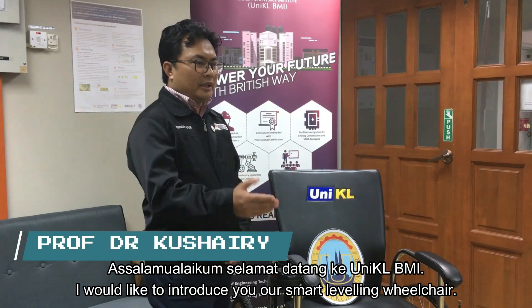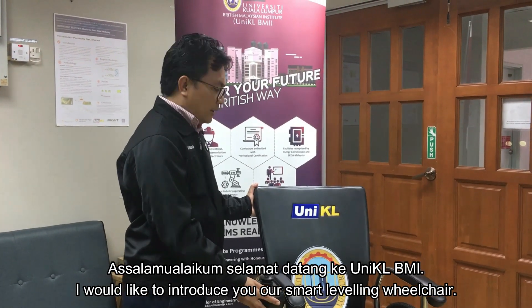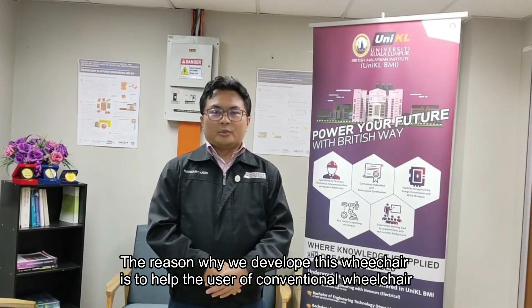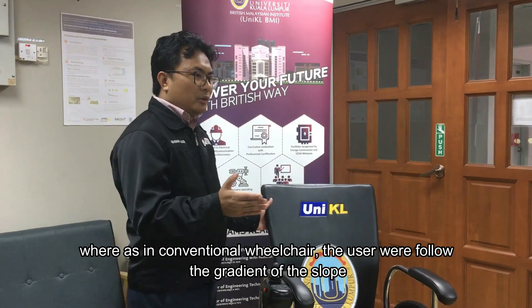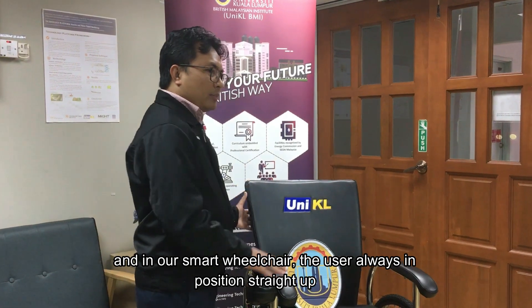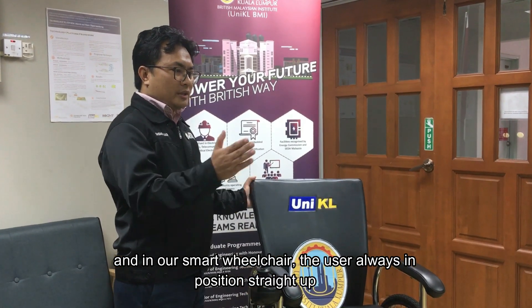Assalamualaikum, selamat datang ke UniKL VMI. I would like to introduce you to our smart leveling wheelchair. The reason why we developed this is to help users of conventional wheelchairs. In a conventional wheelchair, the user follows the gradient of the slope. But in our smart wheelchair, the user will always be in an upright position.